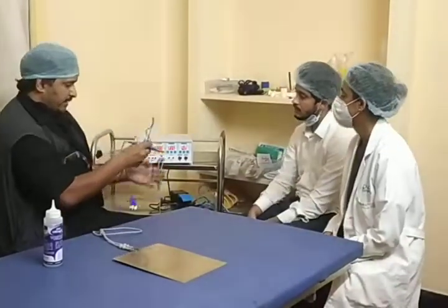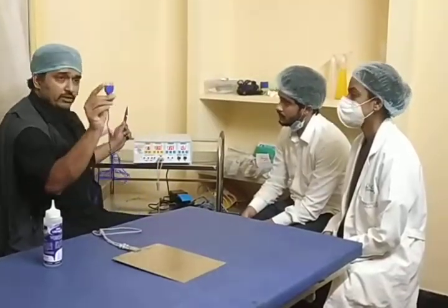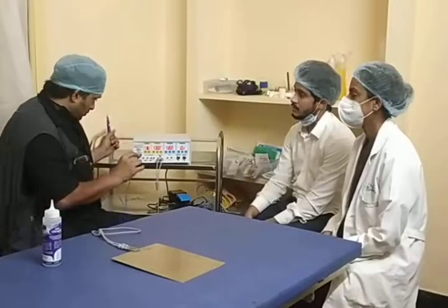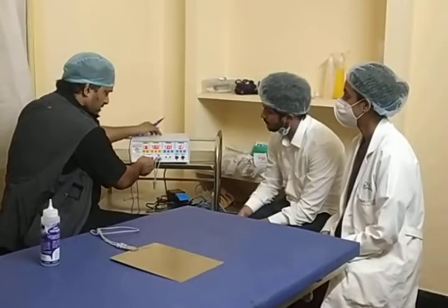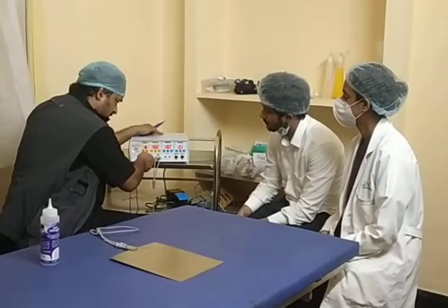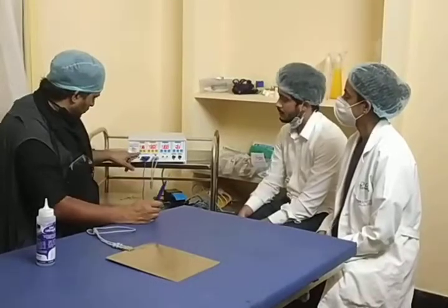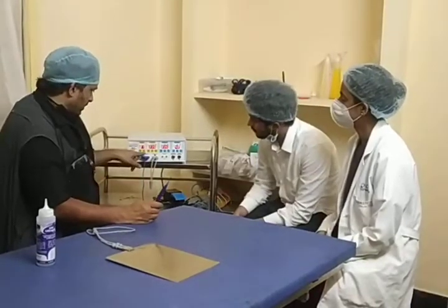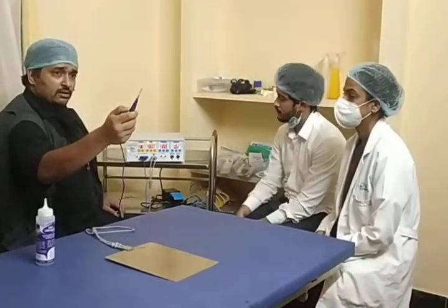And this is the setting over here. If you see carefully, it has a typical 3 options of plug options over here, and it's very difficult to make a mistake over here because these correlate perfectly. And I have connected this over here, and now there is an option over here of active and hand switches. Okay, so I have connected this as an option.